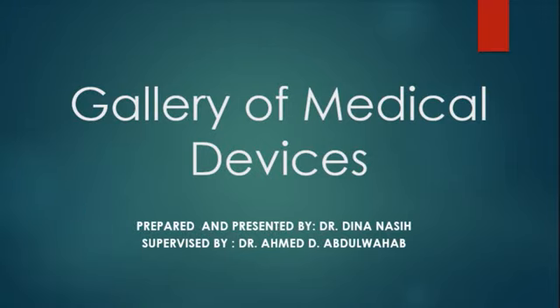Today we are going to talk about a very important thing that we should all know. A while ago we had a chest X-ray. The patient had a central line in it, and none of the attending residents knew what that was.